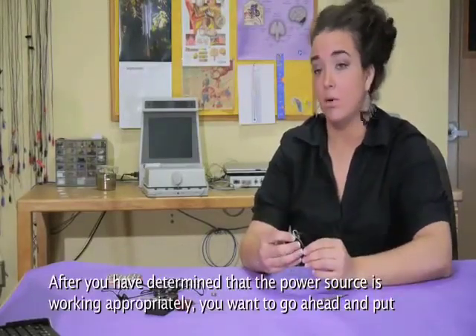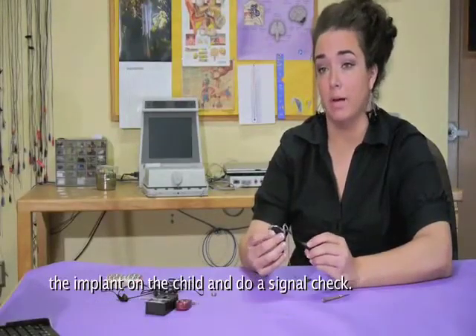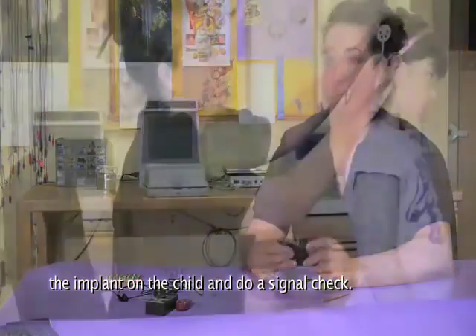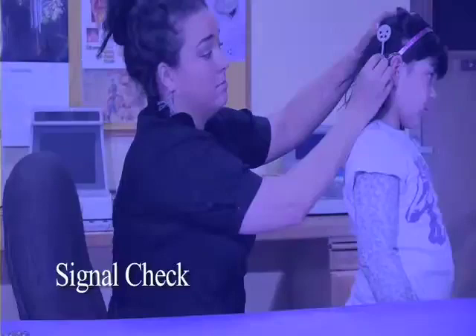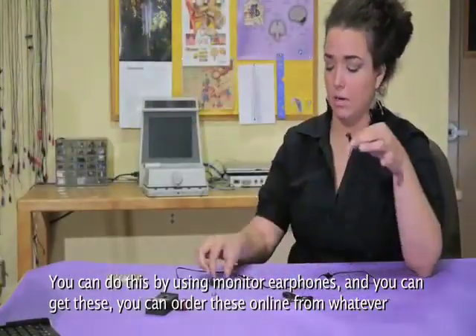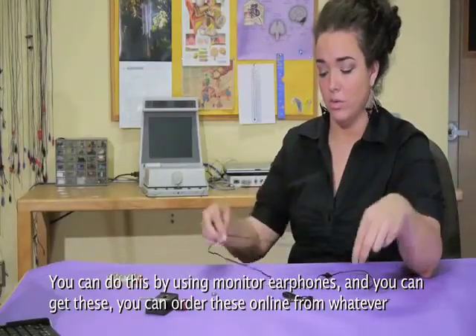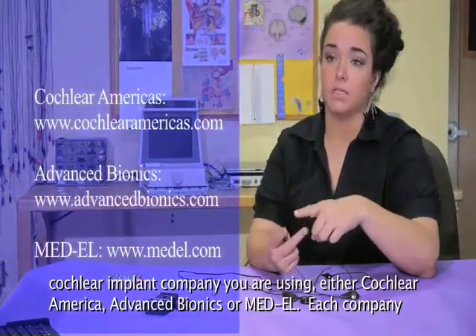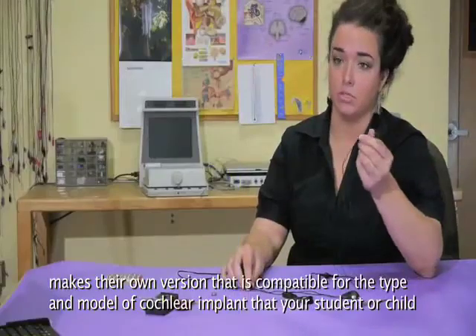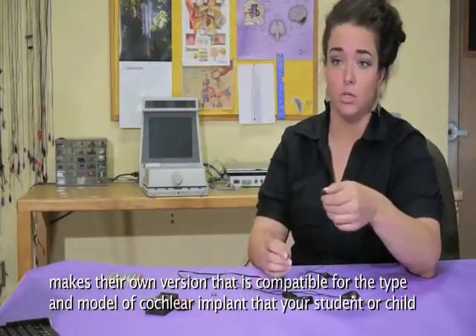After you've determined that the power source is working appropriately, go ahead and put the implant on the child and do a signal check. You can do this by using monitor earphones. You can order these online from whatever cochlear implant company you're using — either Cochlear Americas, Advanced Bionics, or Medel. Each company makes their own version that's compatible for the type and model of cochlear implant that your student or child might have.